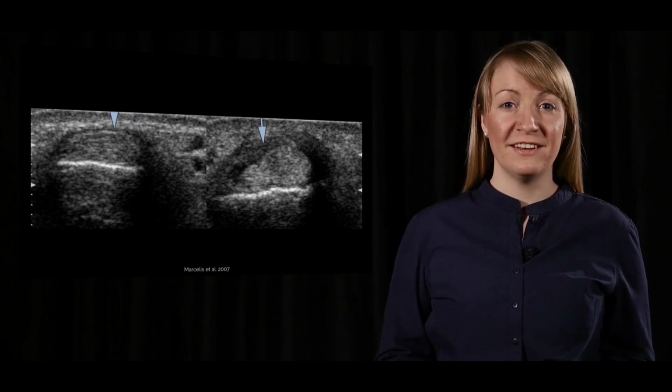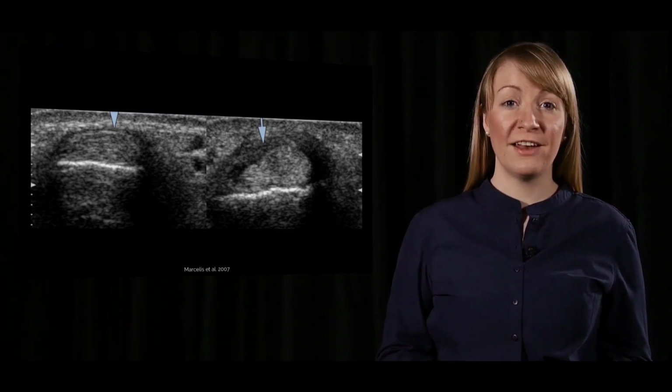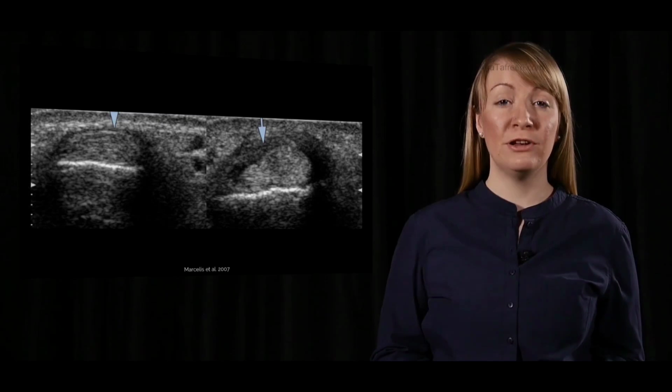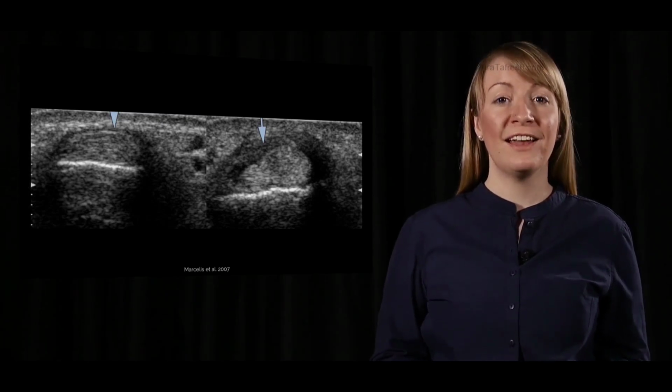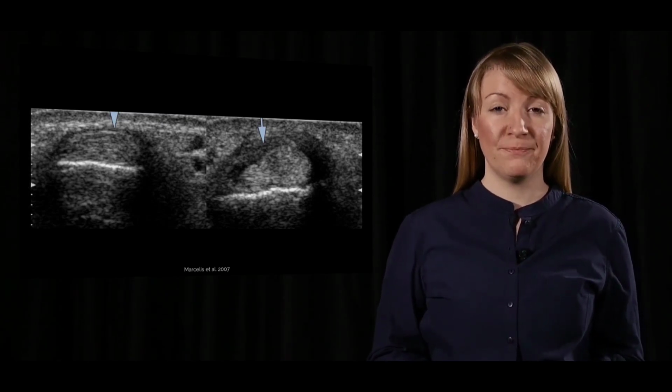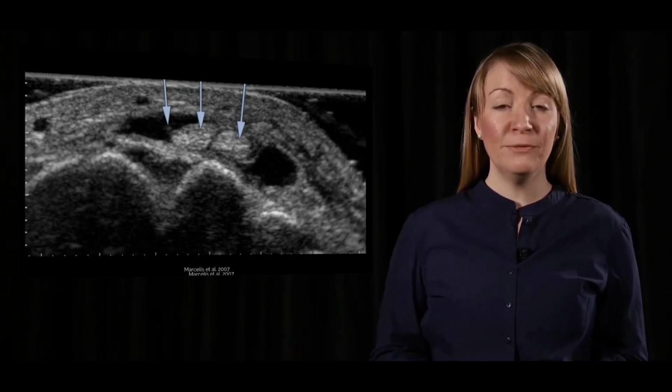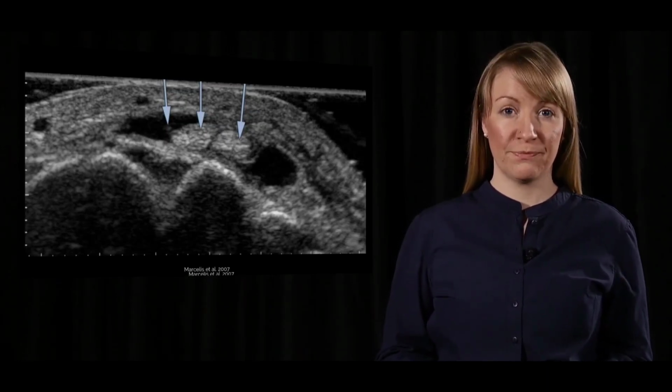Measurements of the tendon and retinaculum thickness and cross-sectional area have to be made to accurately document the pathology for diagnostic and/or evaluative purposes. This is a transverse scan of an extensor compartment of the wrist.